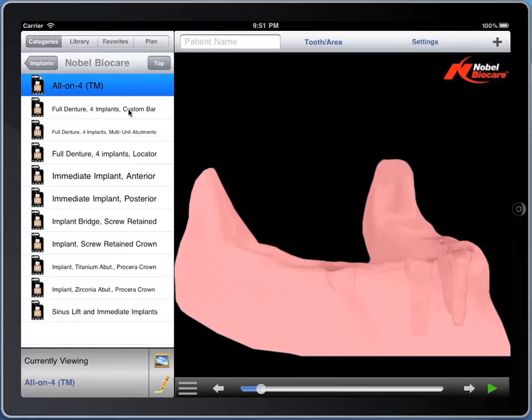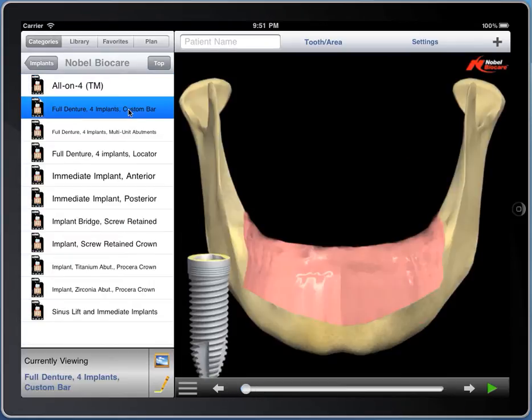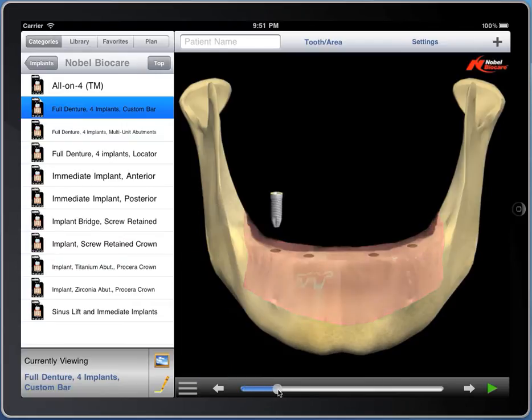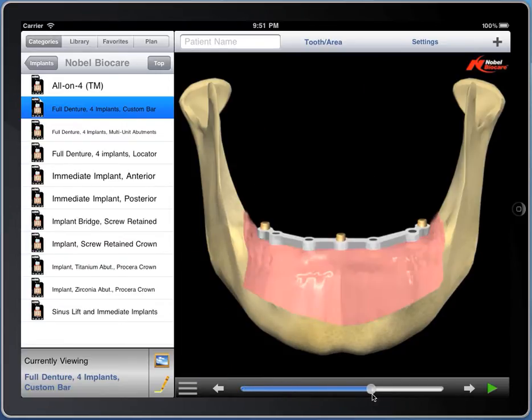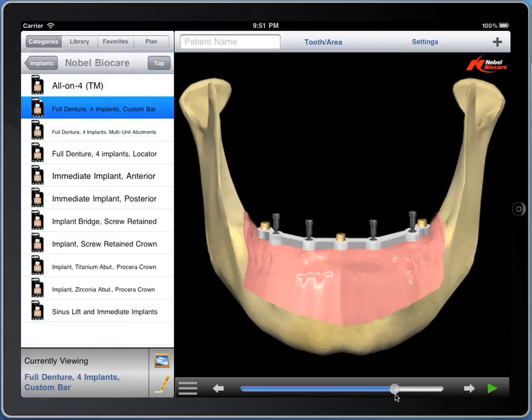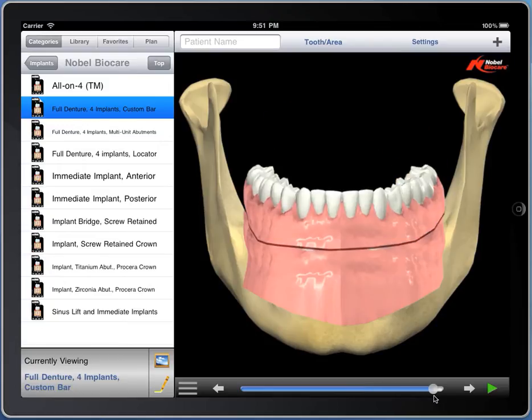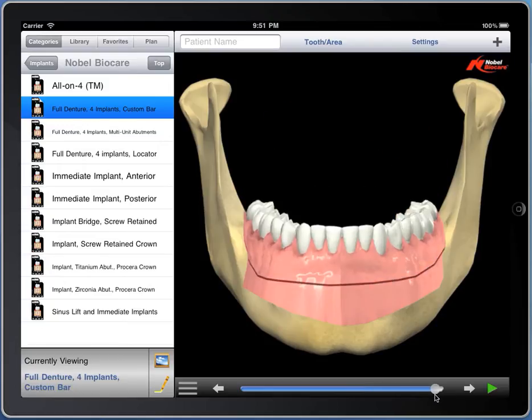The next one I'd like to show you is the full denture using a custom hader-style bar, again made by Nobel with their implant bodies. It shows a custom bar with locator attachments on it, and the denture.